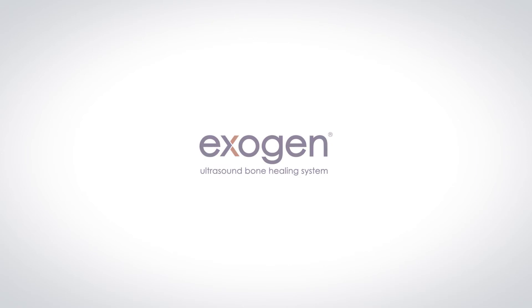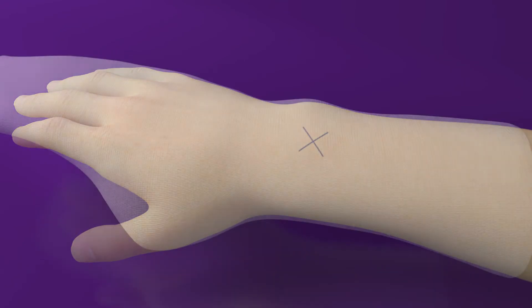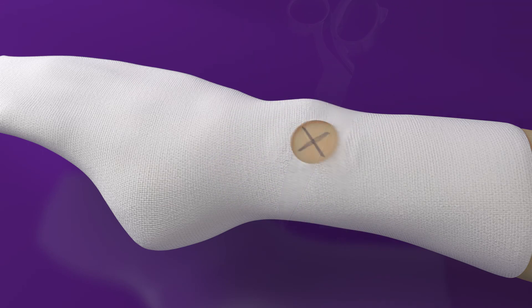This video is an overview of how to build Exogen into a CAST. Mark the treatment area and put on the stockinette. Cut a hole in the stockinette over the treatment site, making certain the marked area is open to skin.